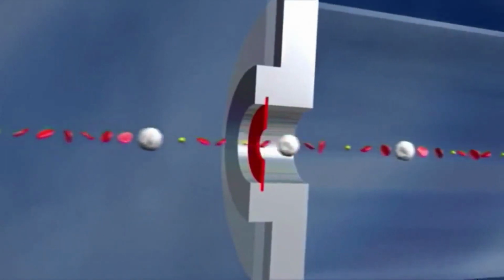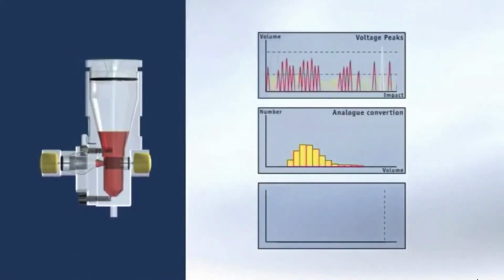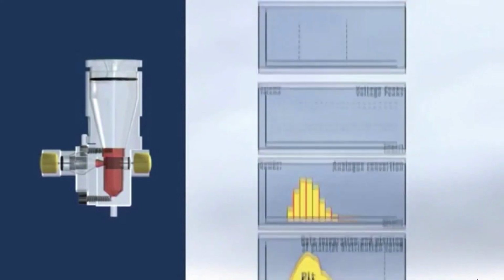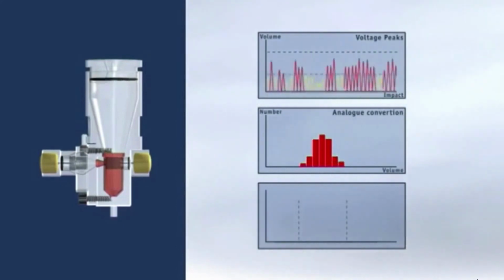In a Coulter counter instrument, a tube with a small aperture on the wall is immersed into a beaker that contains particles suspended in a low-concentration electrolyte. Two electrodes, one inside the aperture tube and one outside the tube but inside the beaker, are placed and a current path is provided by the electrolyte when an electric field is applied. The impedance between the electrodes is then measured.